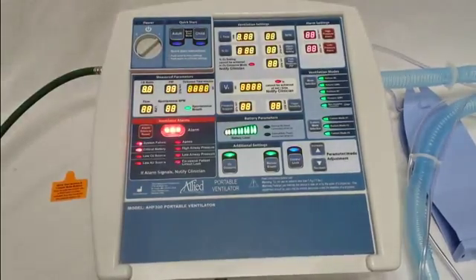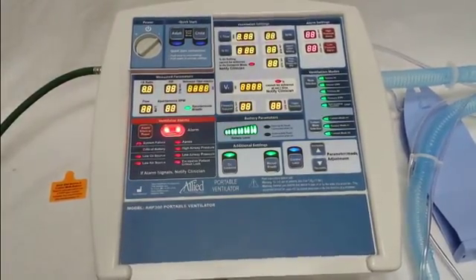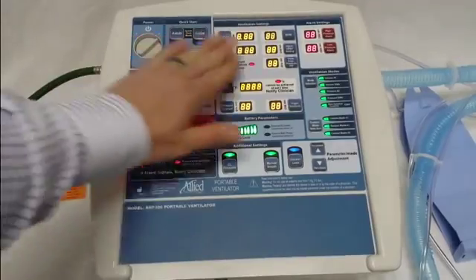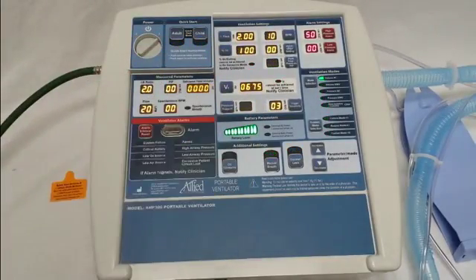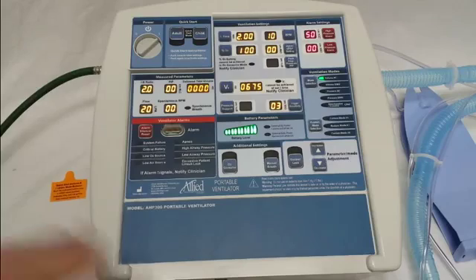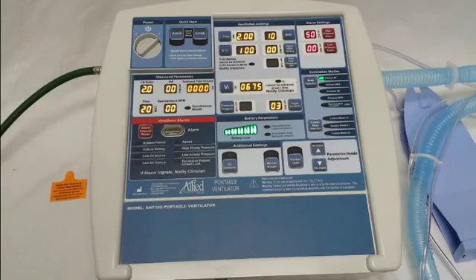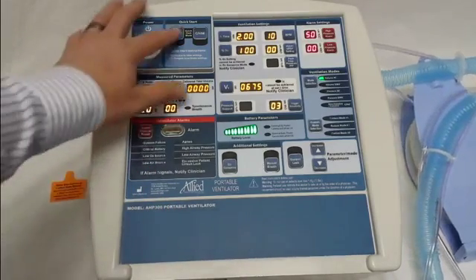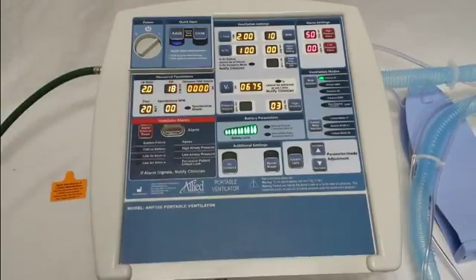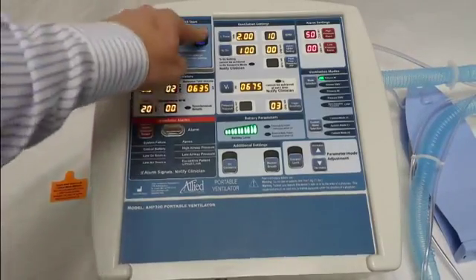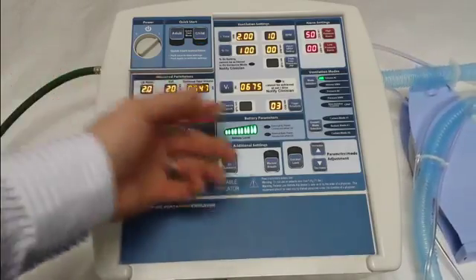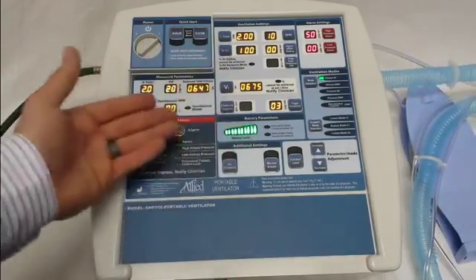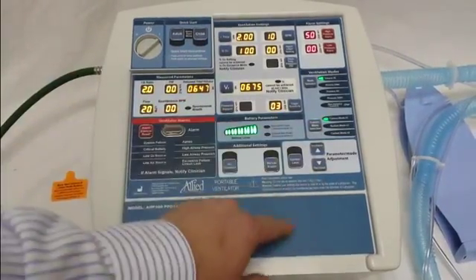We'll go ahead and turn on the ventilator. The first thing you'll notice is it'll go through a self-check and then it'll start ventilating in whatever settings the ventilator was turned off in when it was shipped from the factory. You will notice that the adult mode, the child mode, and the custom modes, when you press them, they beep and they will not allow you to use them.